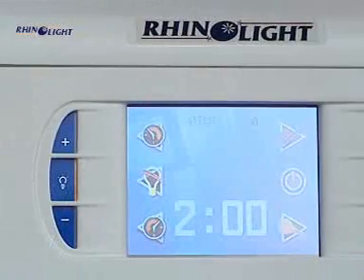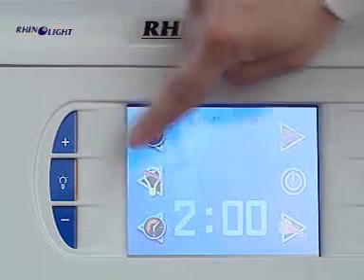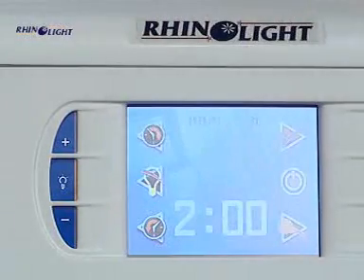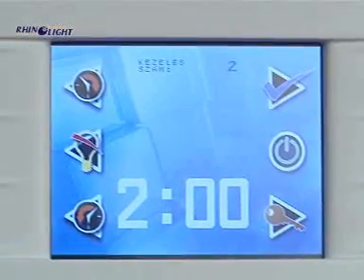The length of the treatment can be set by the second with the large plus and minus buttons on the front. The maximum time is three minutes. The device does not allow longer treatments to be set.